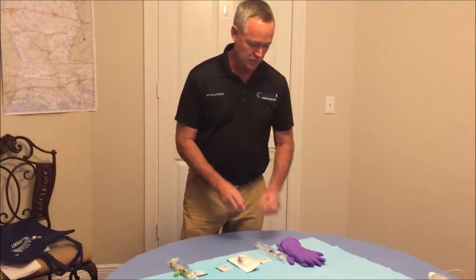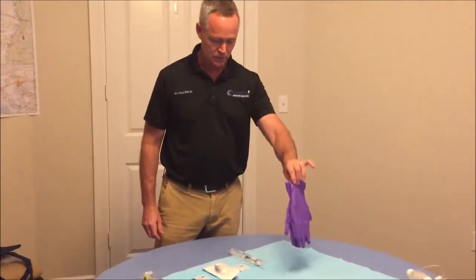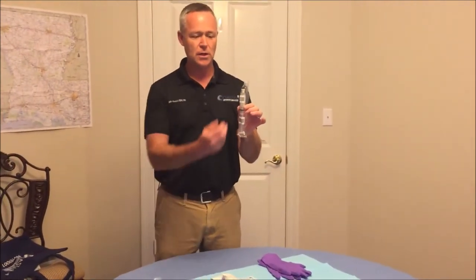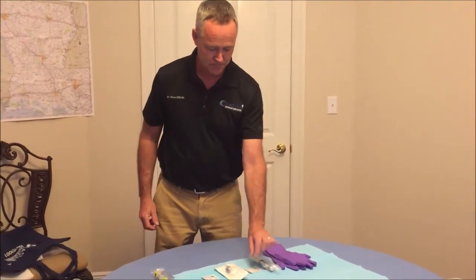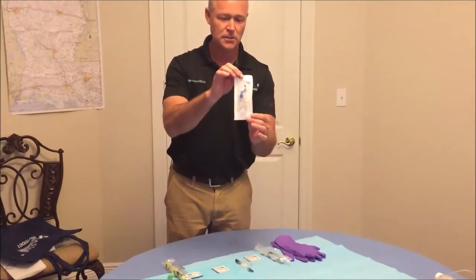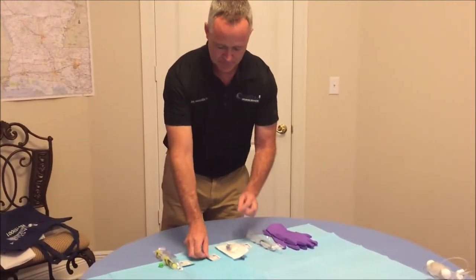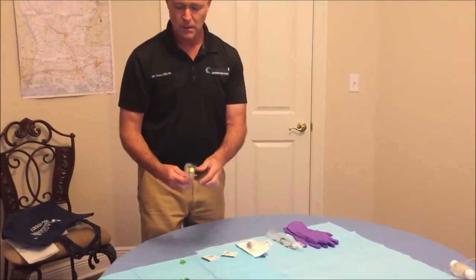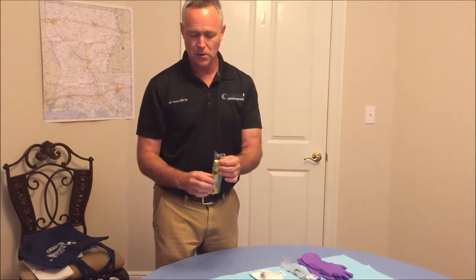The next thing we want to do is lay out supplies. You will need a pair of gloves, one 10cc normal saline syringe — that's the syringe with the white cap — your 14-inch extension set, and three alcohol preps total.